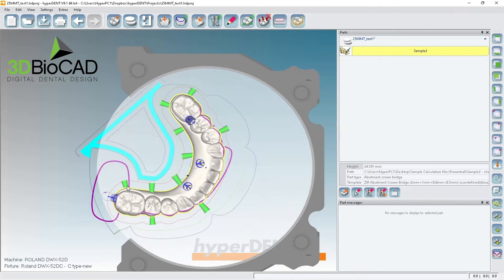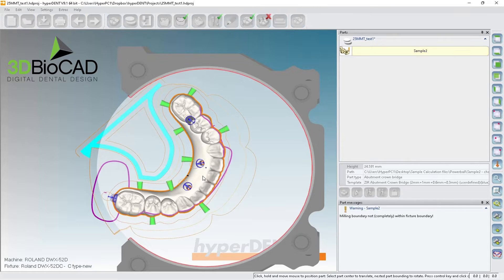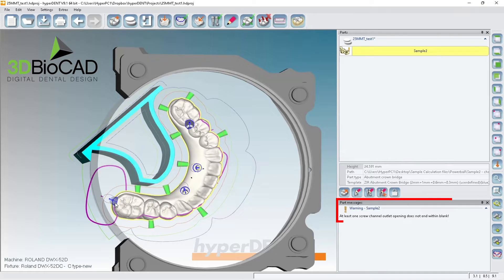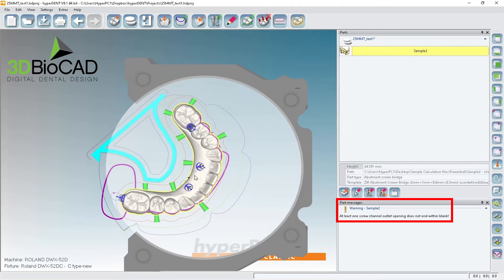This one has nothing so I'll probably delete it, then move this a little bit closer. Make sure it doesn't hit the fixture. There's a warning — basically it's saying one of the channels is outside of the blank, but we don't have a choice for this case, so we just have to do that.